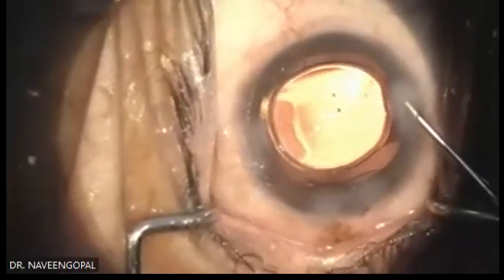Yeah, place it now. Very good. Now see, it is perfectly centered. Now I will close it finally. That's it. The surgery is over.